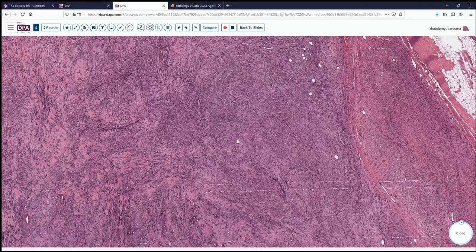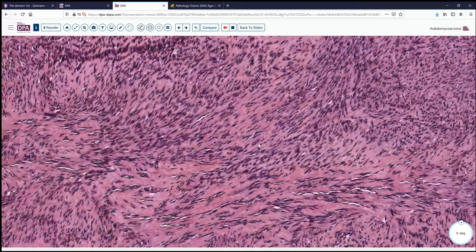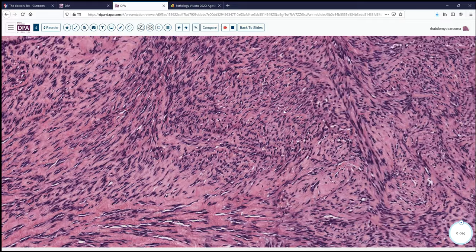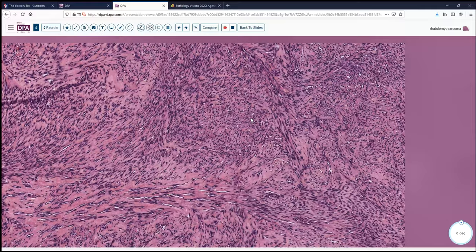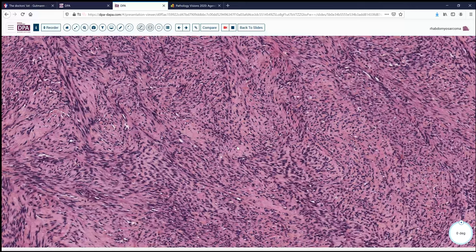At higher magnification, we can see quite a bit of very hyalinized-type collagen and a very dramatic spindle cell pattern with almost a pseudo-angiomatous appearance with little slit-like spaces. There are a modest degree of nuclear pleomorphism, a few enlarged cells, and variable herringbone areas. It is nearly solid throughout with a fairly uniform pattern and a very remarkable hyalinization and collagenization of these cells.